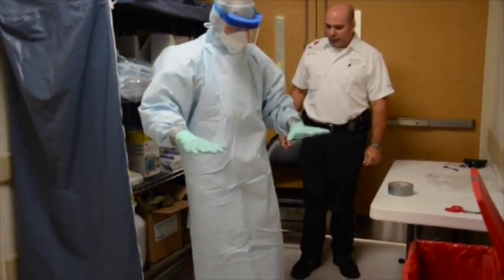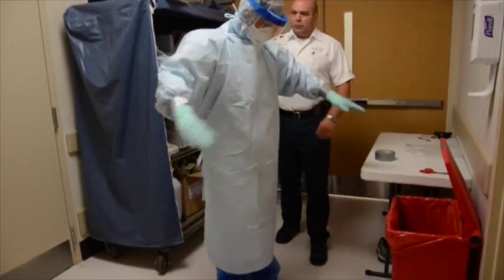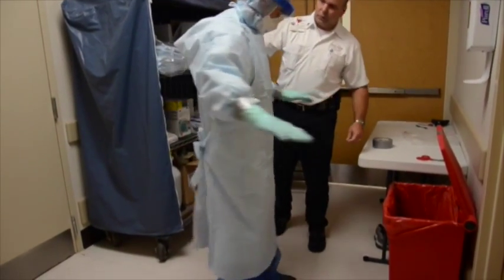The buddy will finally inspect all PPE for proper fit and coverage before allowing the health care worker to enter the patient care area.